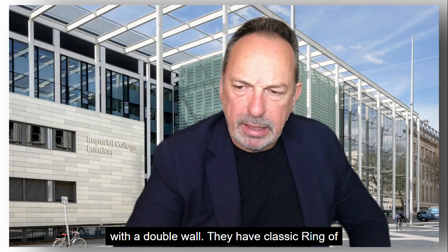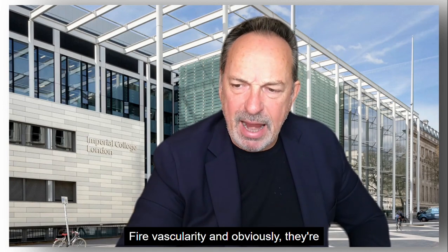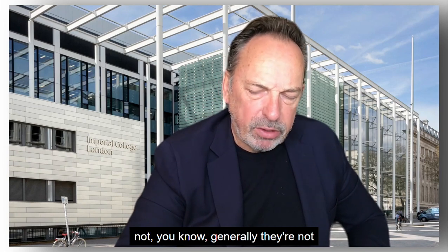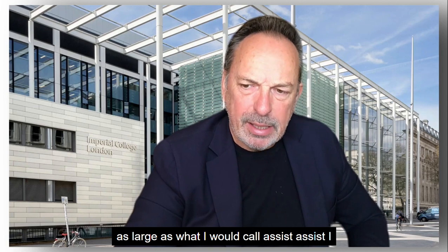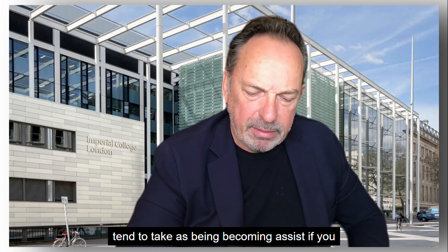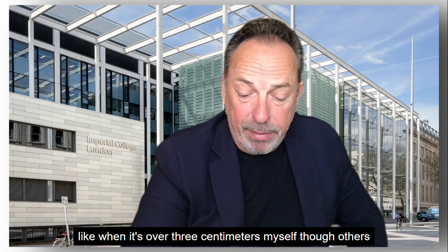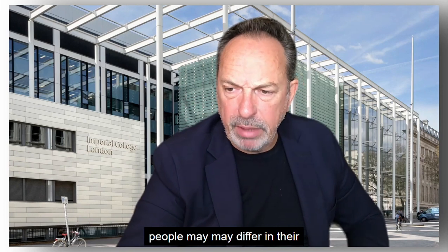They have classic ring of fire vascularity, and generally they're not as large as what I would call a cyst. I tend to take it as becoming a cyst when it's over 3 centimeters, though other people may differ in their opinion.